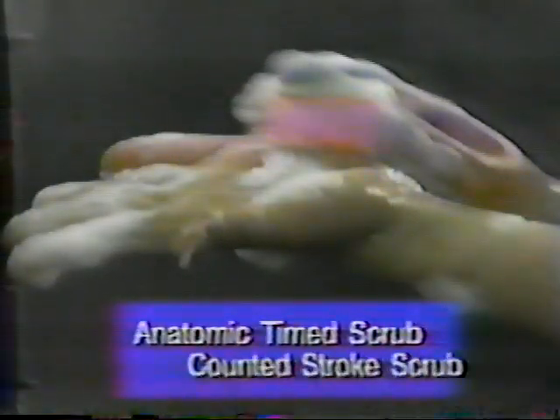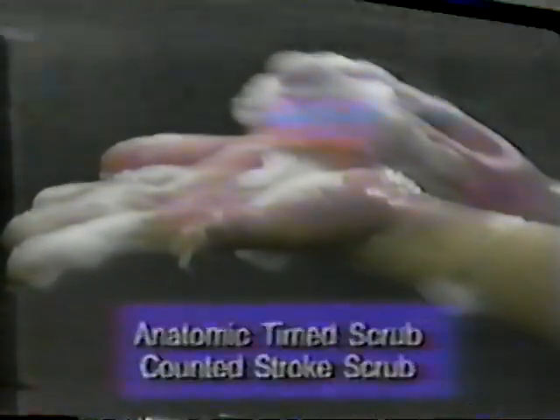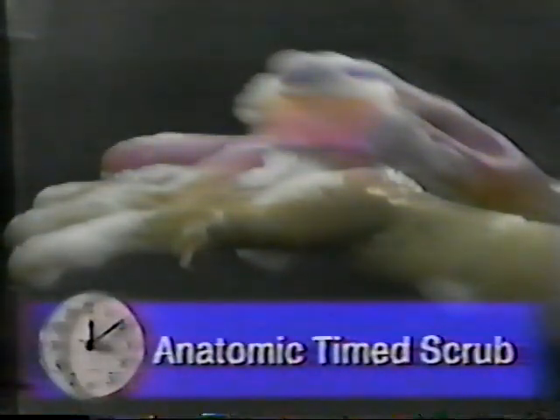The scrub person will use either the anatomic timed scrub or the counted stroke scrub. As the names indicate, the anatomic timed scrub times the scrub of each area. The counted stroke scrub counts the strokes for each area. The scrub person should follow their facility's policy.